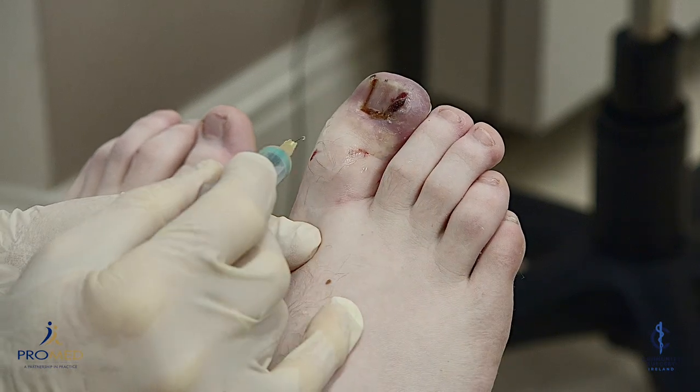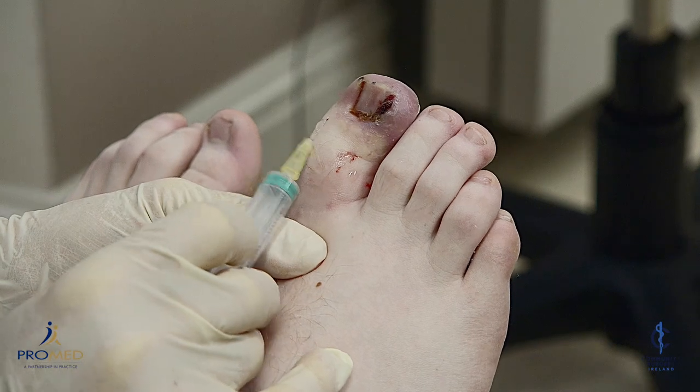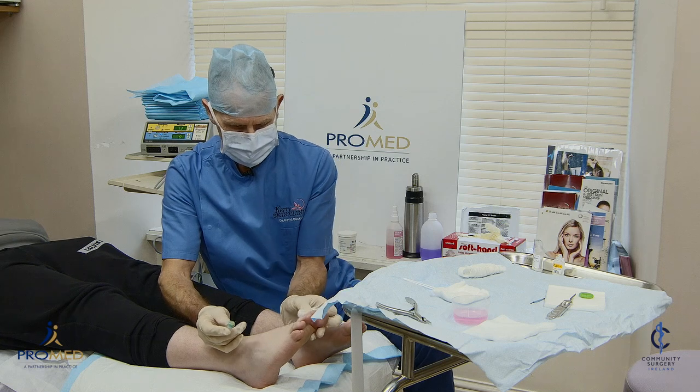So there was one ml down the side, one ml across the top, one ml down the other side, and then one ml local infiltration on each side — five mls in total. We're going to wait five minutes to let that go numb.